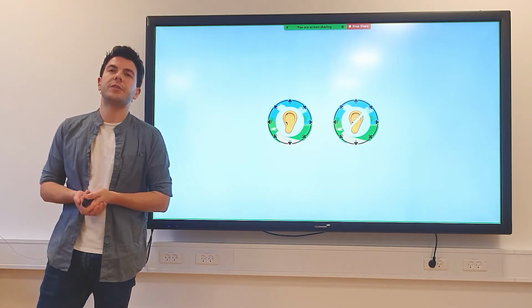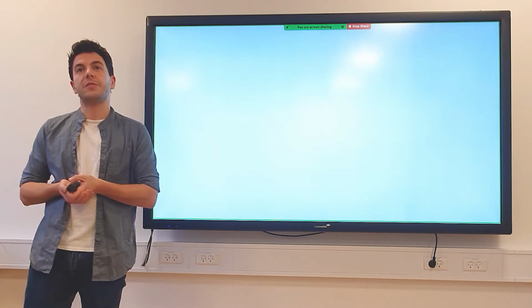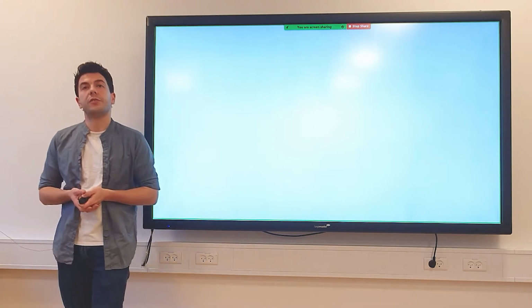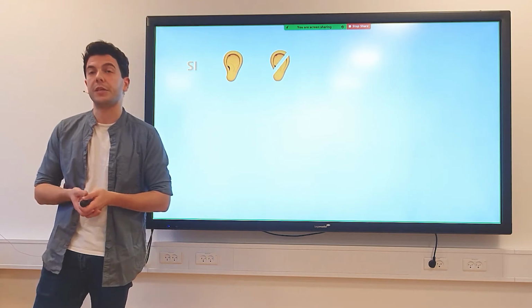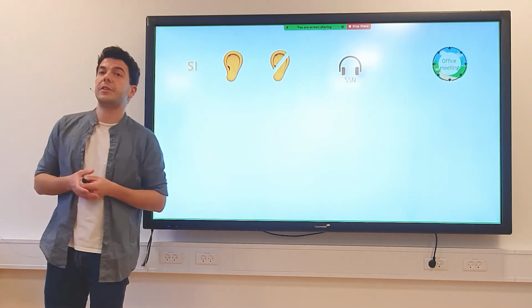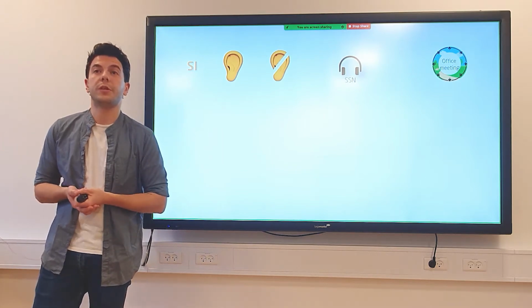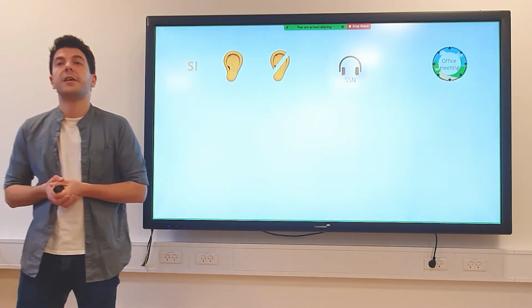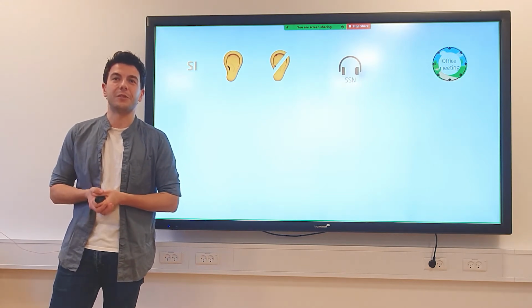In a first experiment, we looked at how normal hearing and hearing impaired participants performed with regard to speech intelligibility, or SI. And we evaluated speech intelligibility for a reference condition with headphones, using speech-shaped noise like you usually do in a speech intelligibility task, as well as our realistic VSE, the office meeting critical sound scenario in this case.